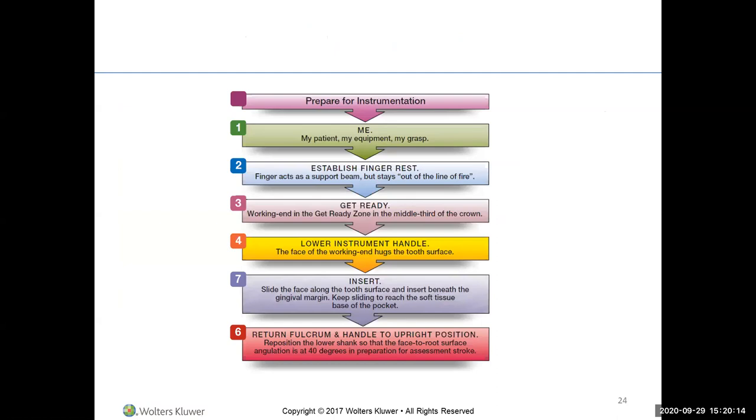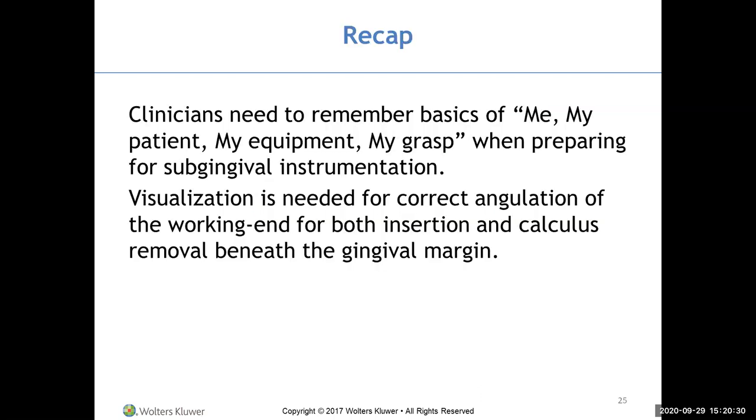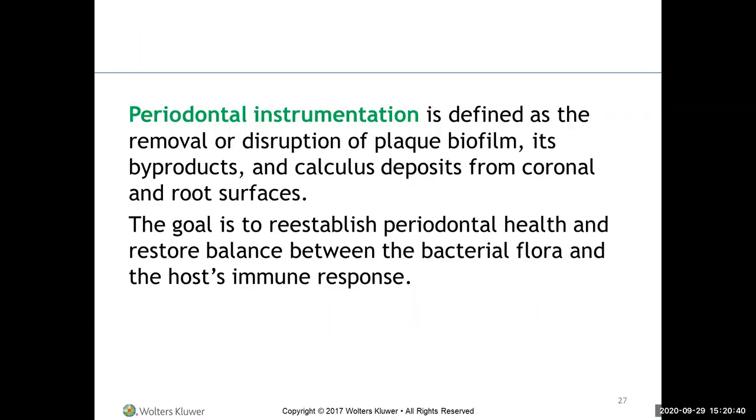Prepare the instrument: establish finger rest, get-ready zone, lower the handle to insert just the toe beneath the gum tissue, sliding the face along the tooth surface, then return the fulcrum and handle to upright position. Periodontal instrumentation is defined as the removal or disruption of plaque biofilm, its byproducts, and calculus deposits from the coronal and root surfaces of the teeth — this is what dental hygienists do every day.